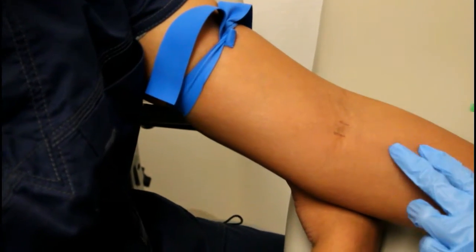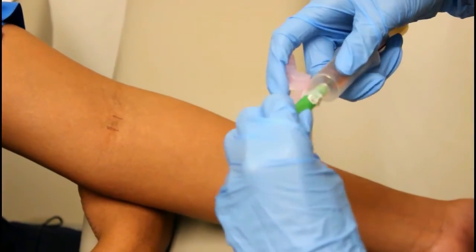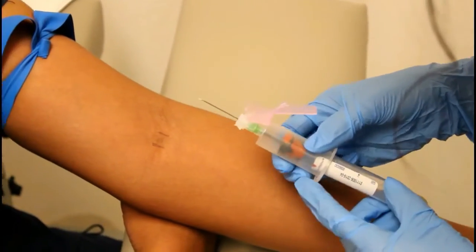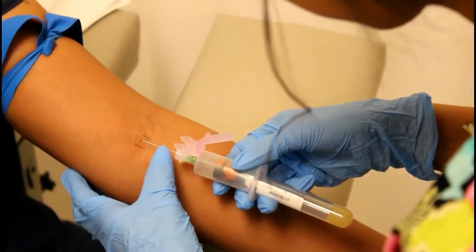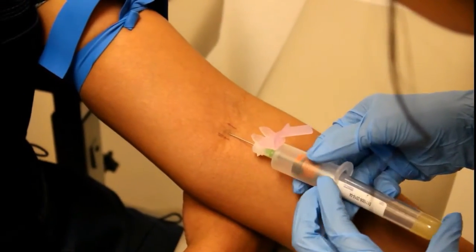Now that the collection site is dry, you'll reapply the tourniquet. Today we will be drawing a purple top tube and a tiger top tube to test for TSH, free T4, and a CBC with differential. Then with the bevel facing up at approximately a 30-degree angle, because we are using a straight needle, you won't know if you are getting a flashback.